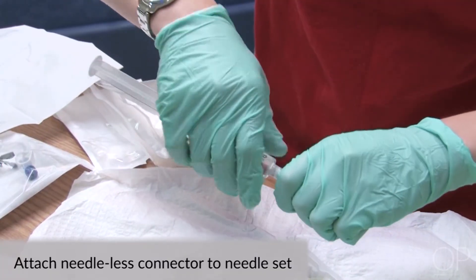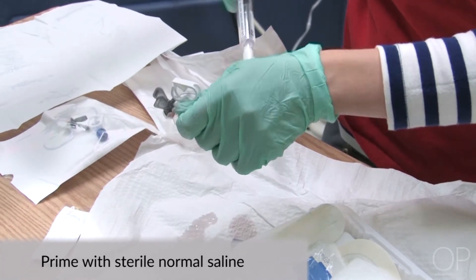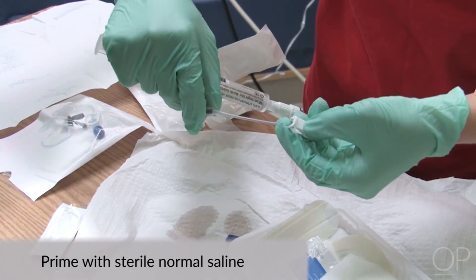Attach the needleless connector to the needle set and prime with sterile normal saline. Close the clamp and return it to your sterile field.